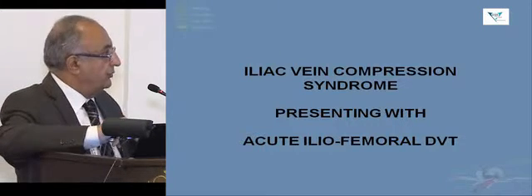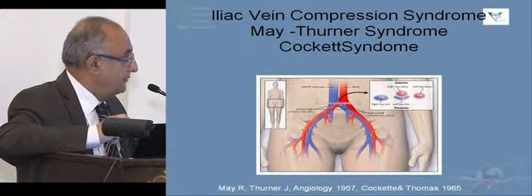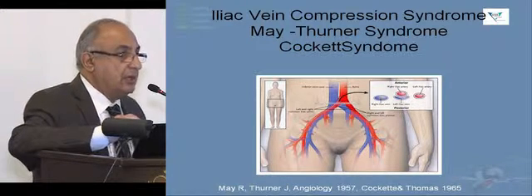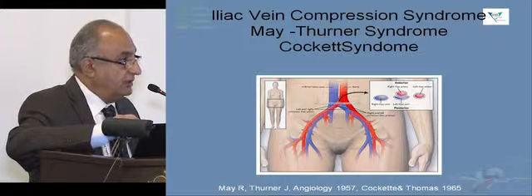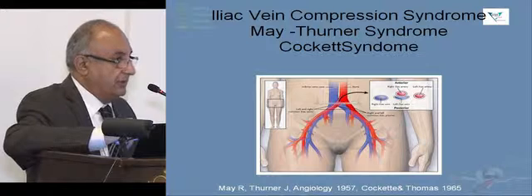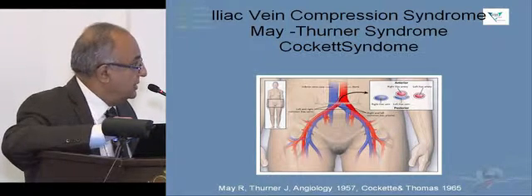This is our protocol of thrombolysis. We always obtain access into the popliteal vein using ultrasound guidance. We use the wire crossing test to assess the thrombus and know if it is soft enough for lysis or not. So if the wire crosses, we go ahead with thrombolysis. If the wire does not cross, we terminate the procedure at this point.